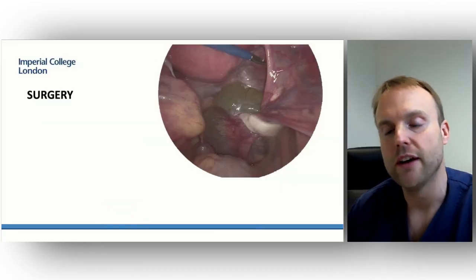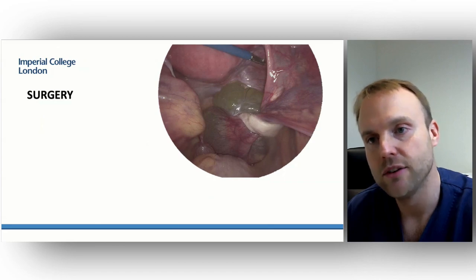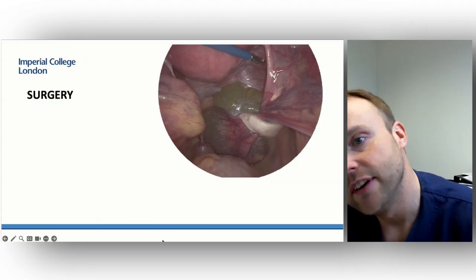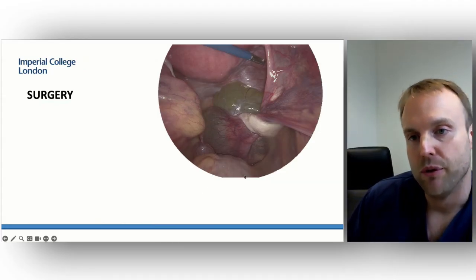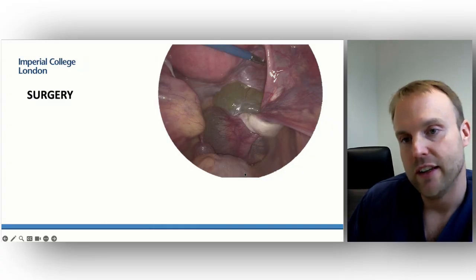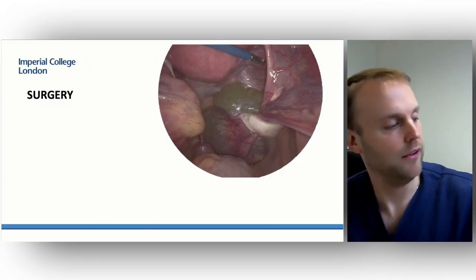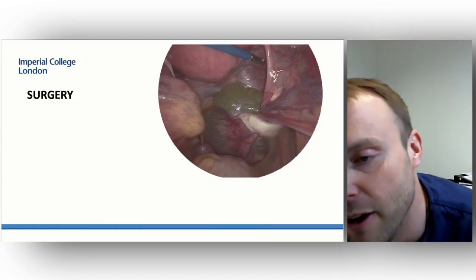We actually observed a torsion of the pedicle on the right side in this adnexa. You can see the tube and the infundibulopelvic ligament that are twisted there on the right. We see the normal part of the ovary as we saw on the ultrasound, the ovarian crescent, and next to that and attached to it, we see this cystic lesion with a solid component, which is not visible behind.